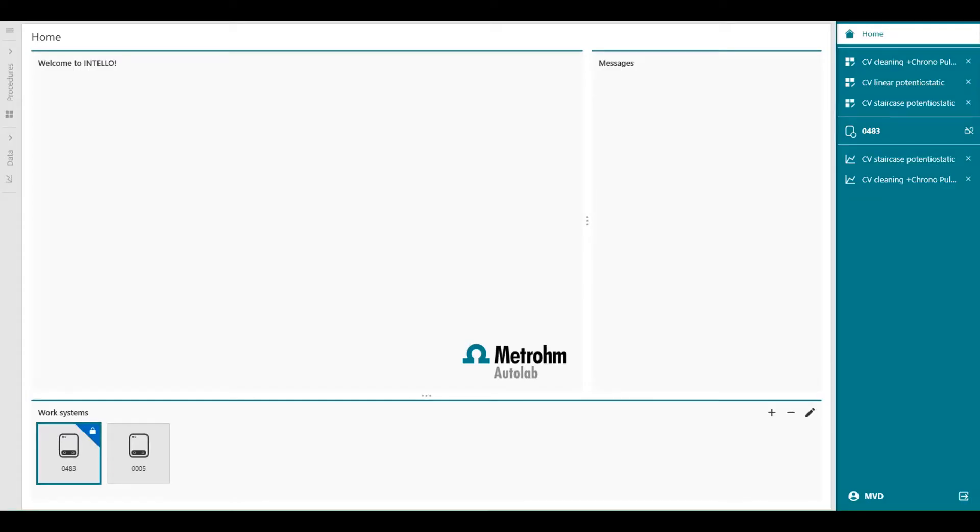In this video, we will focus on how the workflow is organized in Intelo. The navigation panel, which is the green panel on the right side of the screen, improves the efficiency by keeping us organized.